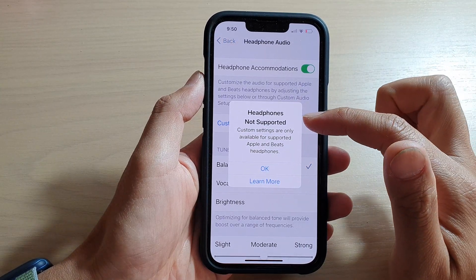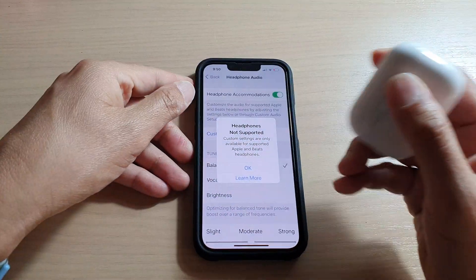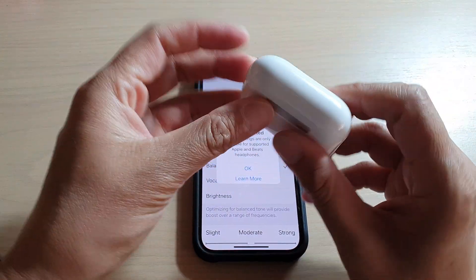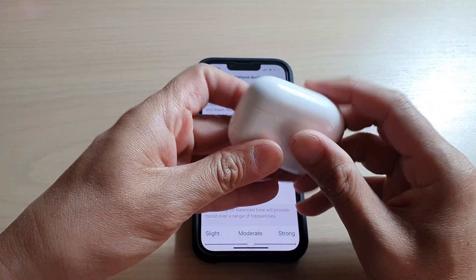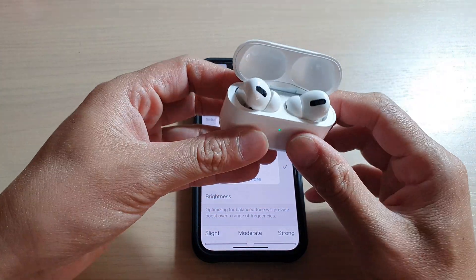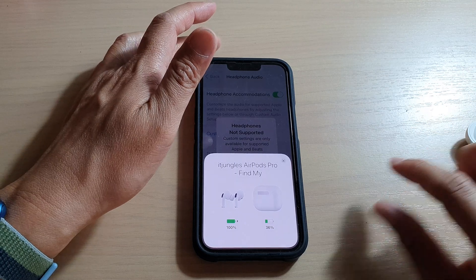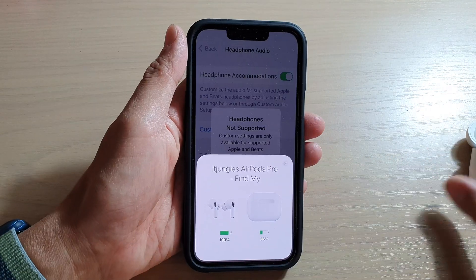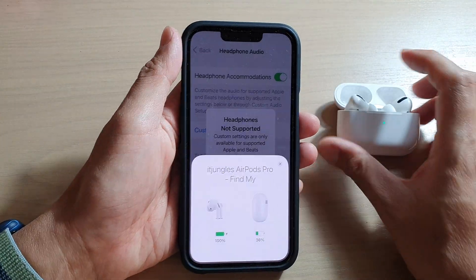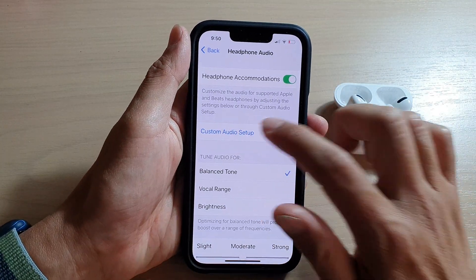It says headphones not supported, so make sure that you have already paired with a headphone. Here I've got the Apple headphones or the Beats headphones — make sure that you have already paired to your headphone. Then we try again.